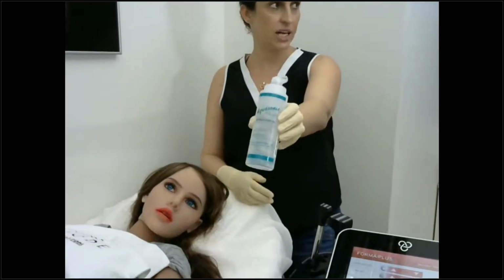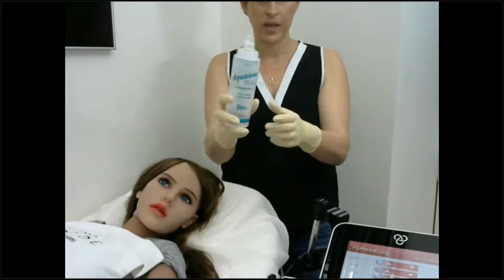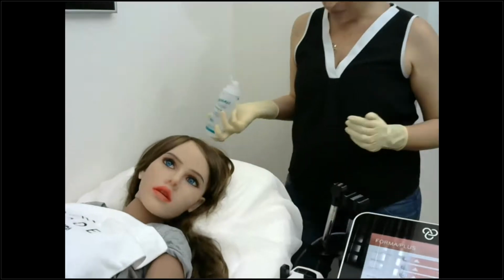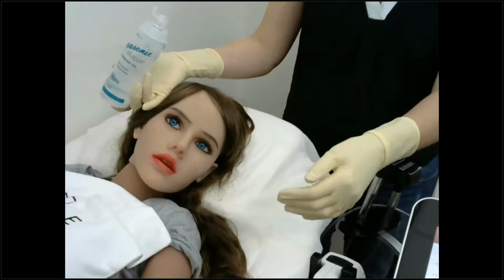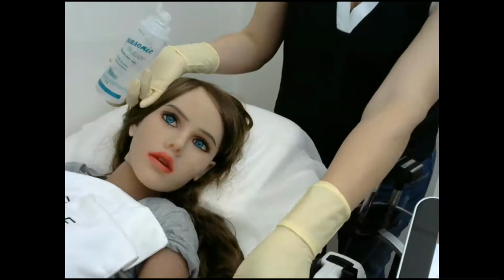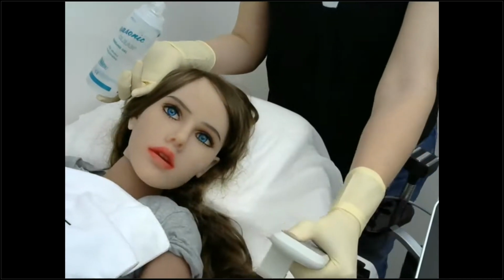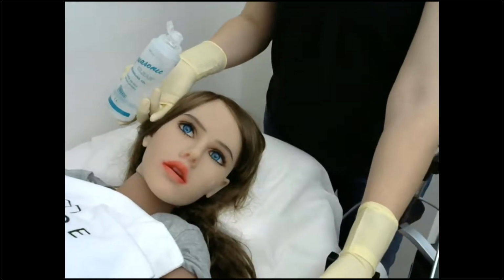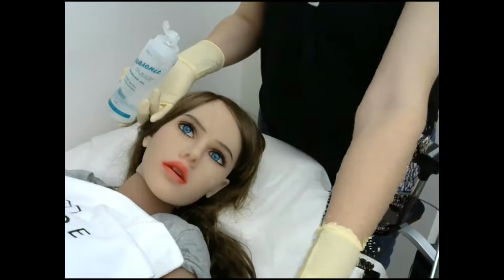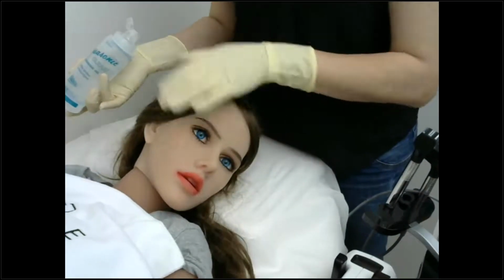And using ultrasound gel, I want to apply some gel on my patient, especially because I'm about to give a relatively long treatment now. It is very important for me to make sure that I'm comfortable.